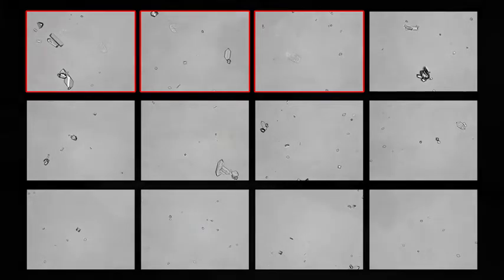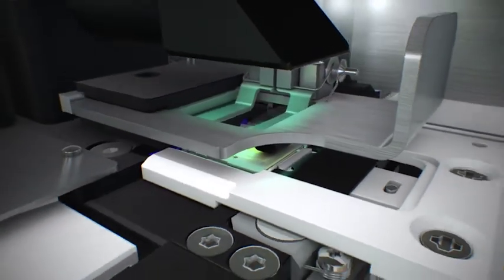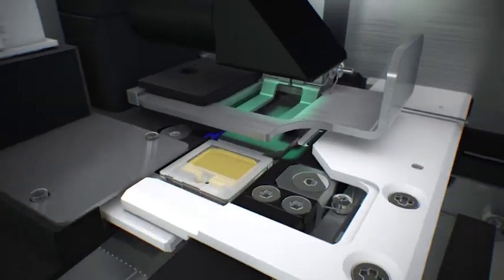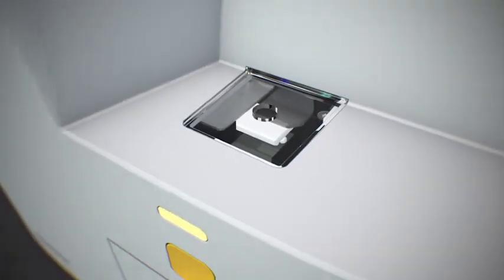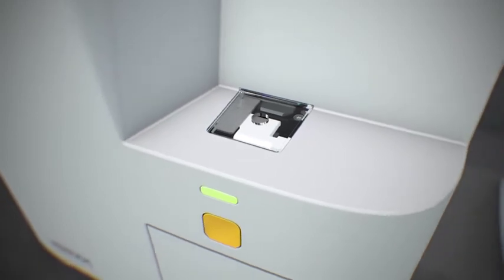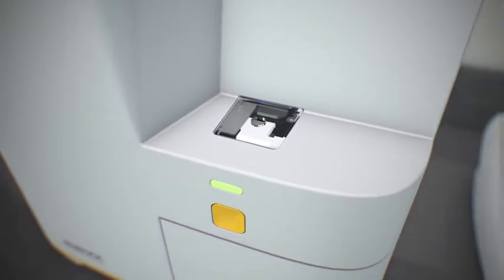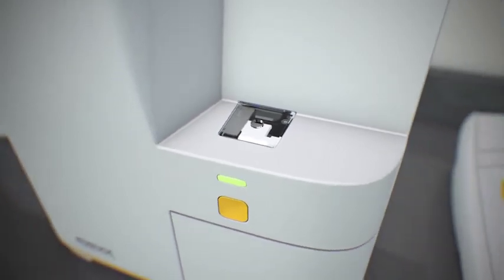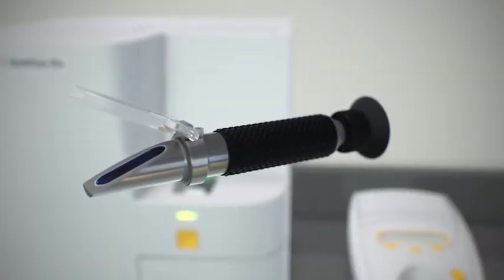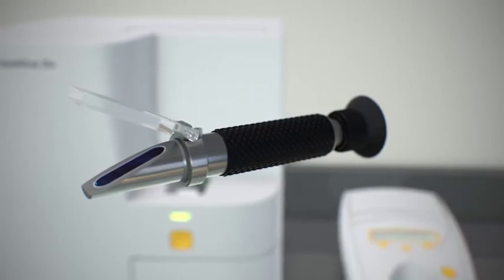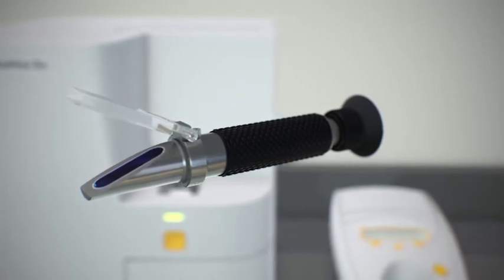After SetiView DX completes the analysis, the cartridge is discarded. While the SetiView analyzes the sample, you can perform your physical exam and specific gravity measurement using a refractometer.